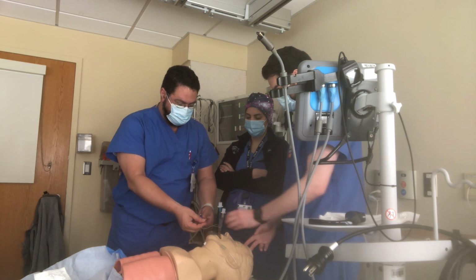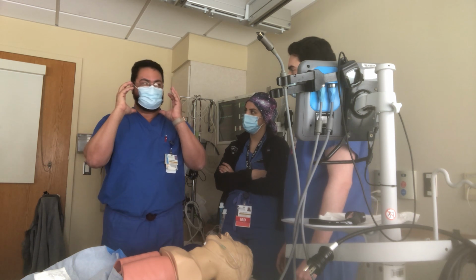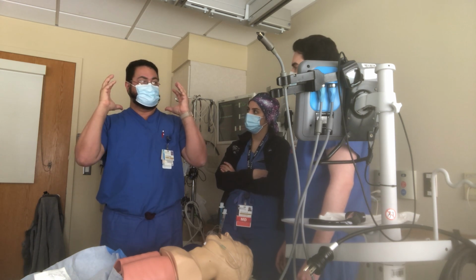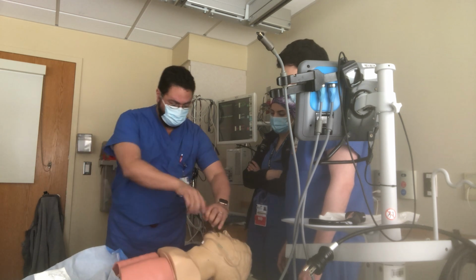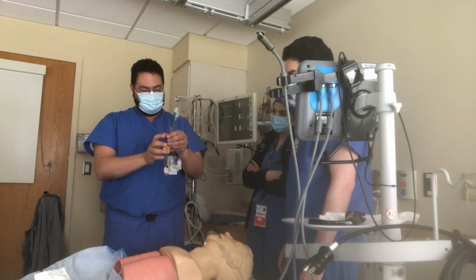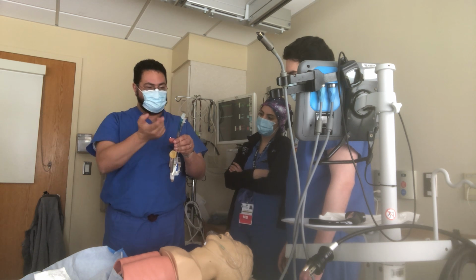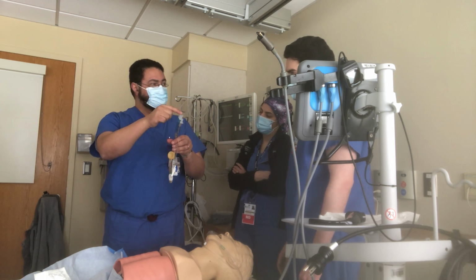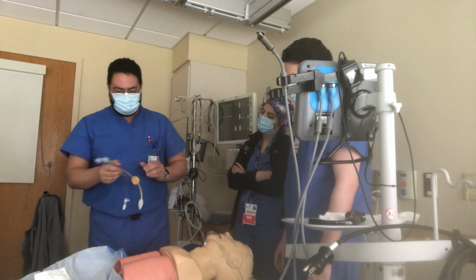Here you put 100 cc's. So that little balloon that you see in the pharynx seals the pharynx, and the other one seals the esophagus, and these little holes here are going to be the ones ventilating above the trachea. So this is above, this is esophagus, the trachea is here. So you test each one. You don't know which one is where. You put a CO2 detector here. If it gives you CO2, ventilate from here. That's it. It's very simple.